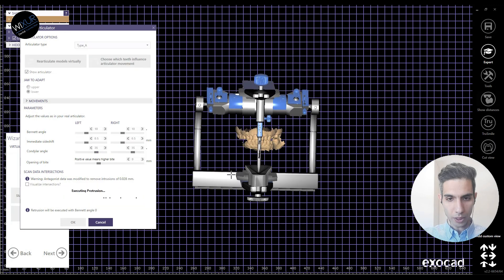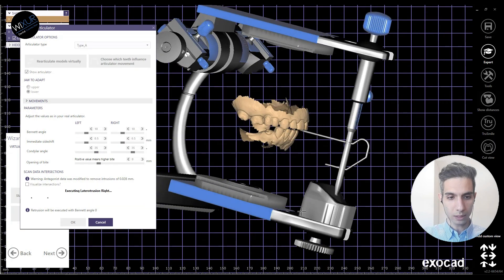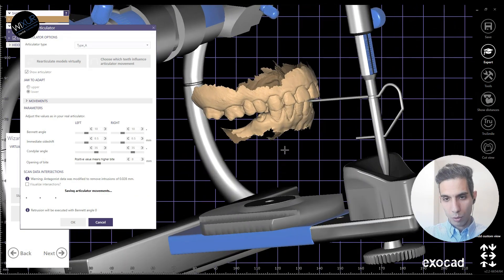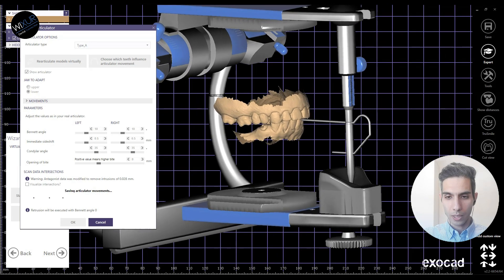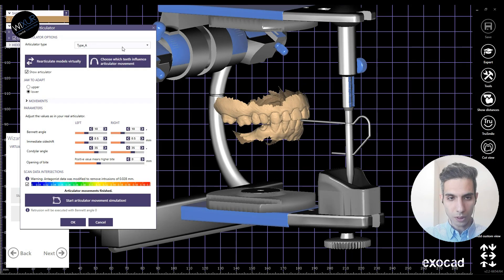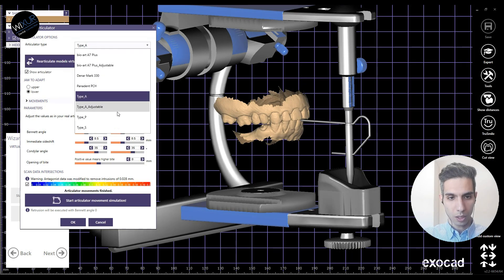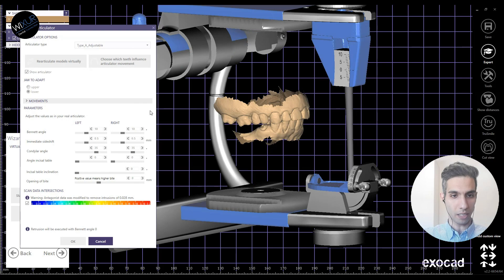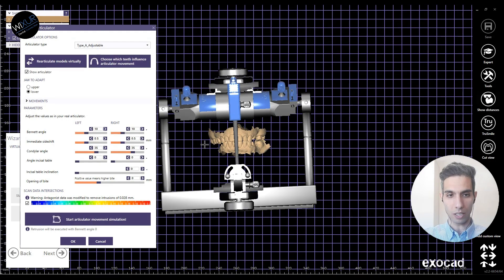Here are my models and the virtual articulator movements are now starting — it takes some time. You can also change the articulator type here in the drop-down menu. I'll change it to a Type A adjustable, Artex style adjustable one.